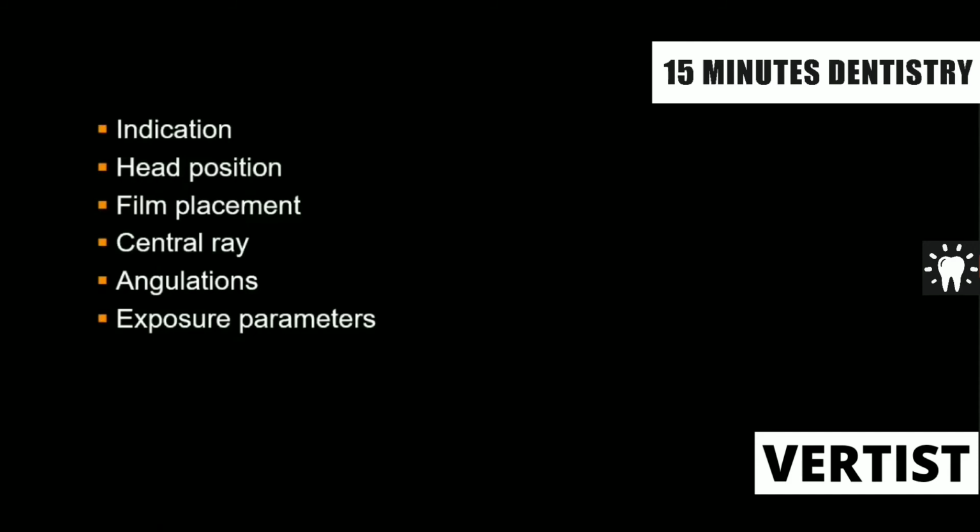What will be the head position? That means the placement of the head. This will be taken in the extraoral. Either there is an extraoral radiographic table, which you might have seen, or sometimes there is even a chest stand. On that, how are we going to place the head? That means what will be the position of the forehead, is the nose touching or not? That will be the head position.